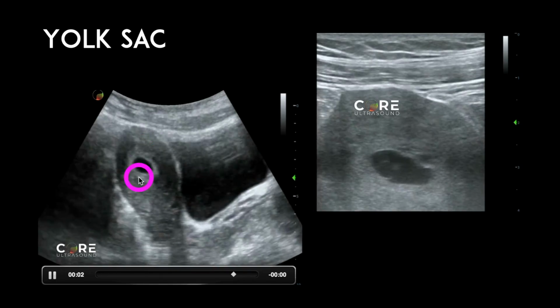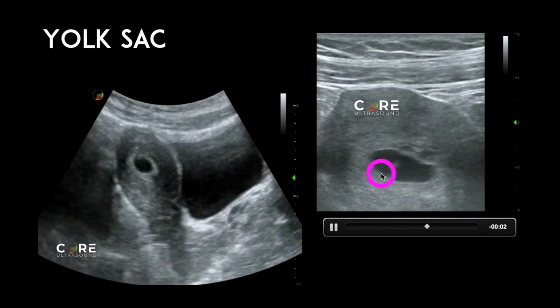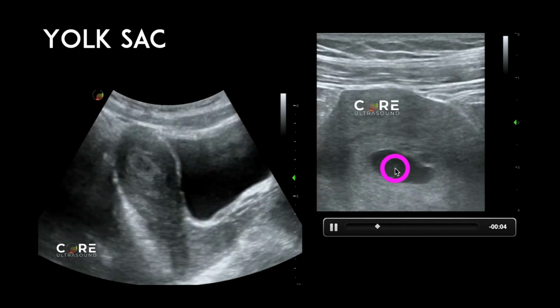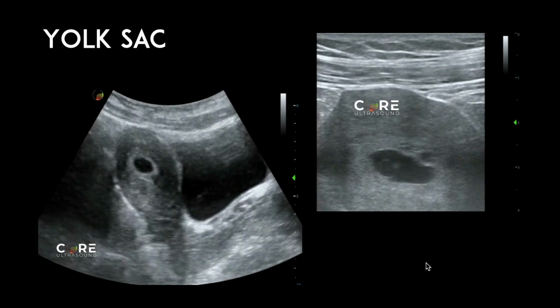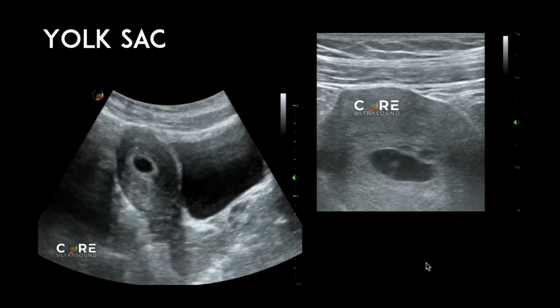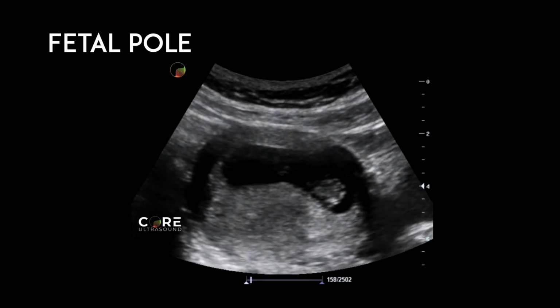anterior abdominal wall, which we are seeing here. Switch to that linear transducer and look at that high definition right here. You can easily see that little Cheerio of that gestational sac with what is likely the very early fetus right here with a little cardiac activity right there. You definitely can use an endocavitary transducer as well, but the endocavitary transducer is a bit more invasive. So if you can get by with using the curvilinear or the linear transducer, probably more comfortable for the patient.